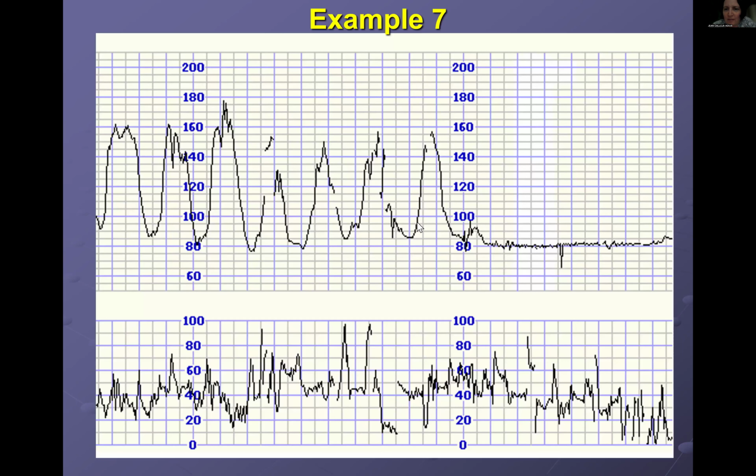You all agree that this is the bradycardia over here, right? We're going to go through the Dr. C. Bravado. So determine risk: high risk because of the previous section and the bradycardia, which is here. Determine risk, so high risk.